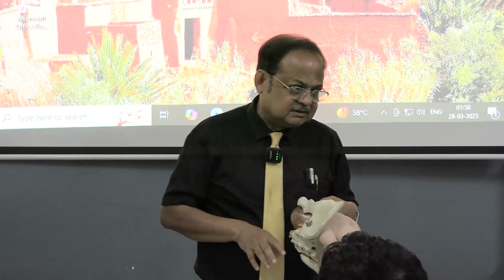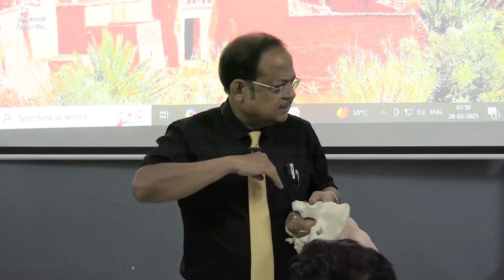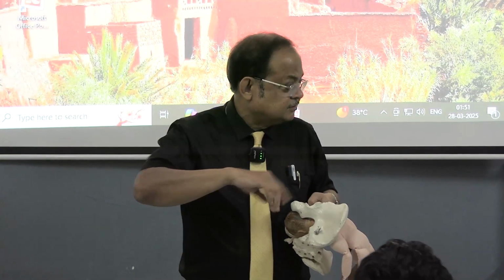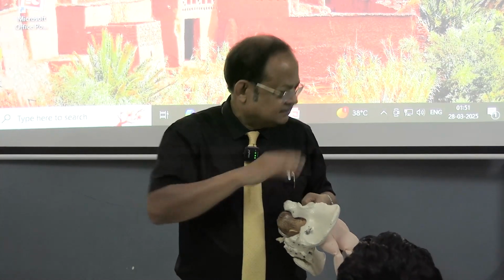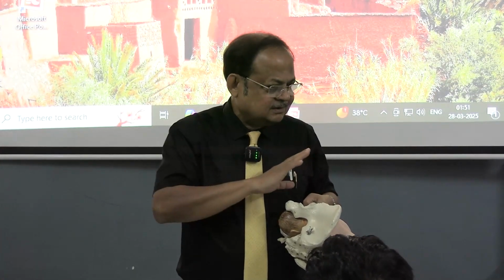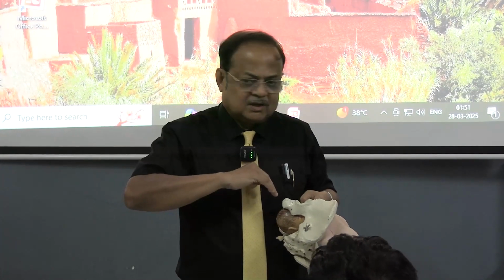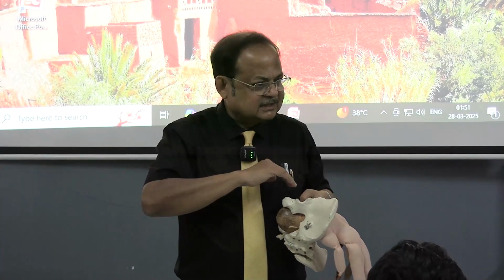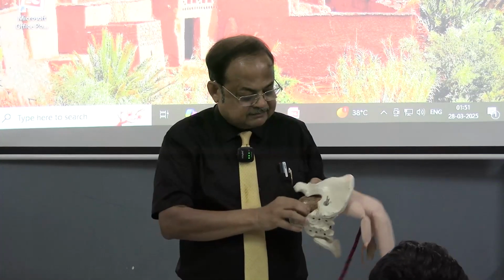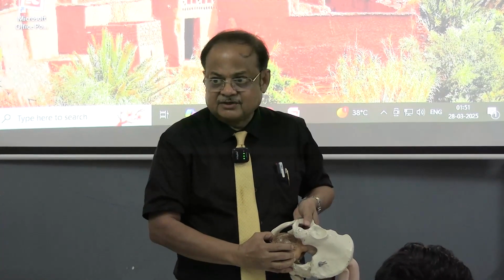Now the classification of the forceps. One is the outlet forceps, one is the low forceps, and one is the mid forceps. Outlet forceps means the head is on the perineum, that is the outlet forceps.